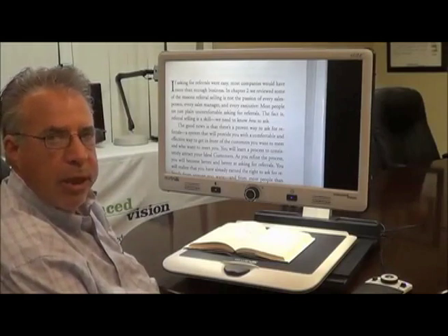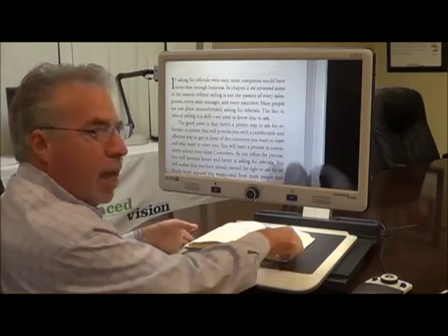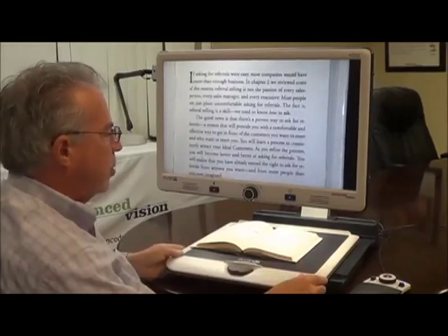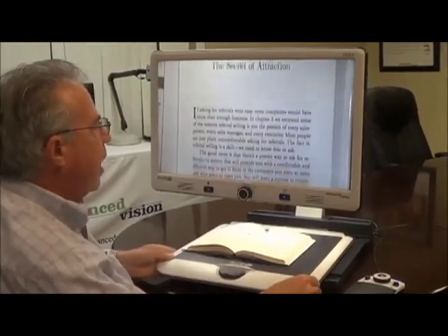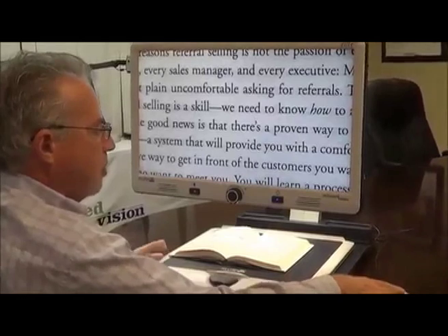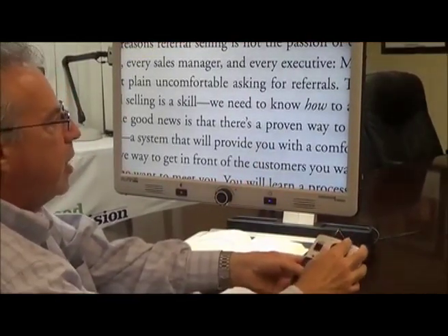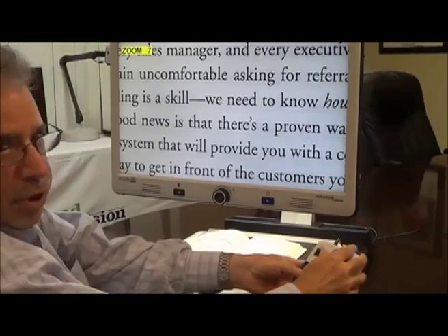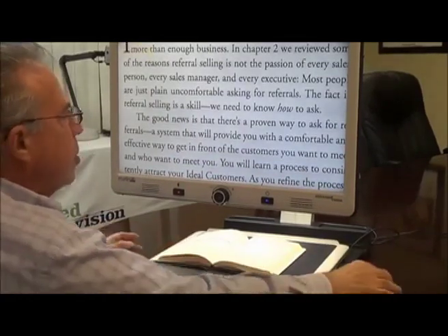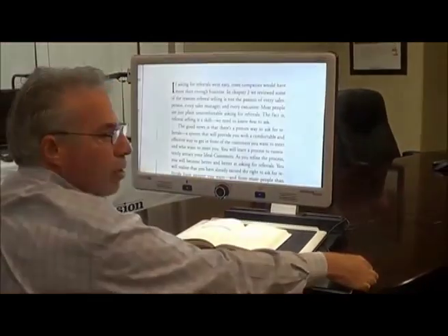You can use the Merlin Elite Pro to look at any type of reading material. A moment ago we were looking at a magazine; now we're looking at a book. You just open the book, place it on the XY table, and you'll note that the table can move to the right and left, up and down, so you can easily scan any document or book. I have the capability to adjust it using the included controller. You can hear in the background that as I adjust the magnification, it announces the zoom level. You have a wide range of magnification to choose from, as well as many background and foreground colors — these are all standard features.